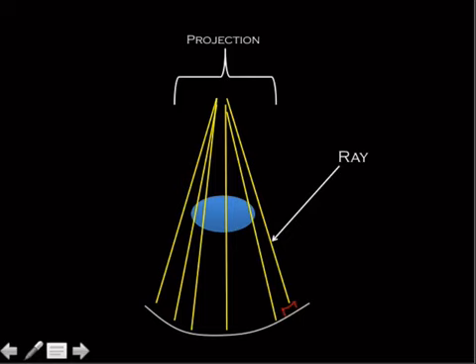The only real reason that I introduce these terms is that if I say there's more projections, then you would say there's better resolution. Why is there better resolution? Because you've collected more data. So more lines, more projections, better resolution.